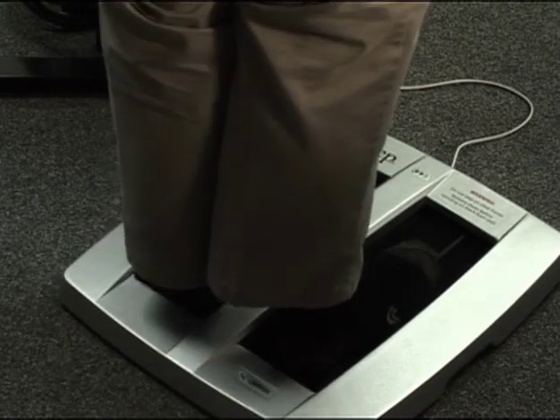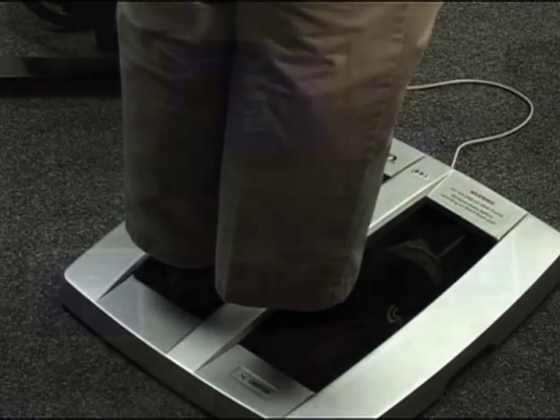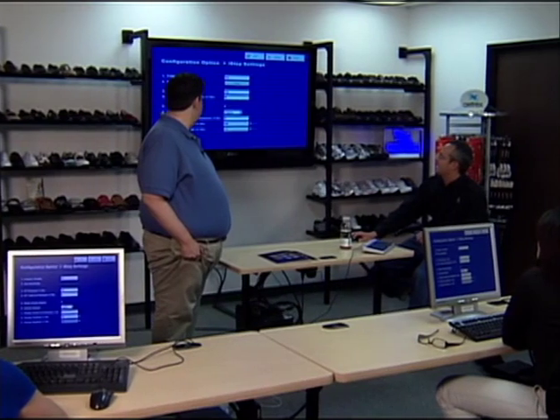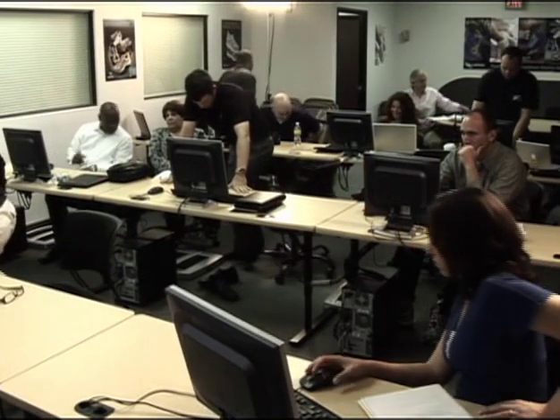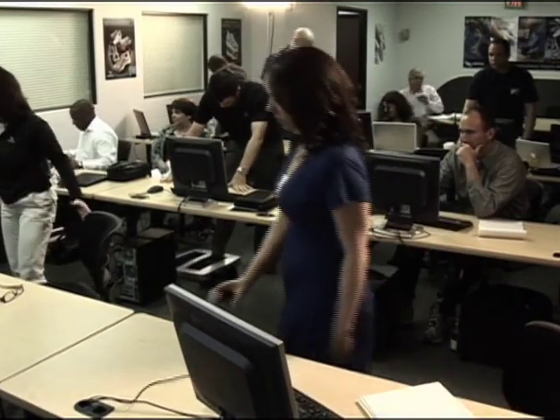We're going to go back into number three, configuration, number one, I-STEP settings, and we're going into set sensitivity. So if everybody can do this, stand up and actually stand on your plate and have your mouse handy to do some adjustments. That's why I asked Dan to do this.